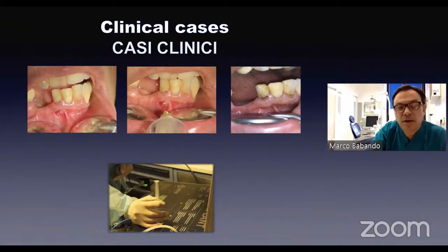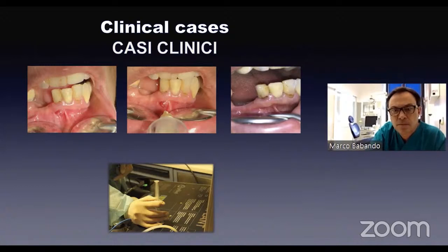The patient has this lower incisive tooth that was very much damaged, so she couldn't spend too much money, and had these severe lesions without some tooth already. The patient wanted to wait for financial reasons, and the fistula developed. Although this is an easy surgical site, she doesn't want to undergo surgery, but she doesn't want to lose the tooth. So we are going to work on the fistula, and we had a complete healing, although the dental element was not relevant. 2 years after, we visited the patient, and the situation was completely resolved. Unfortunately, we weren't able to include any picture of this visit.